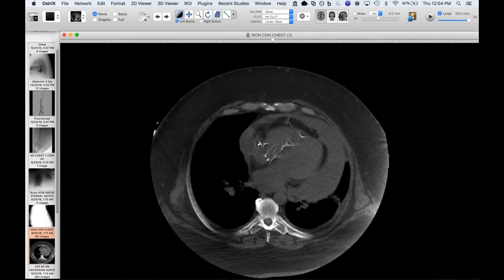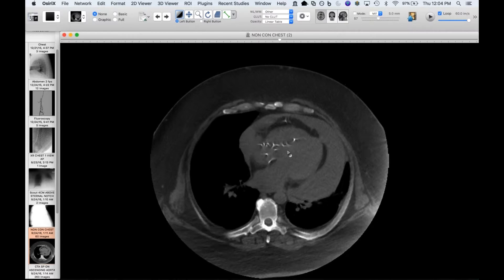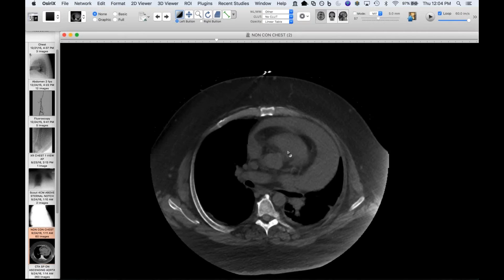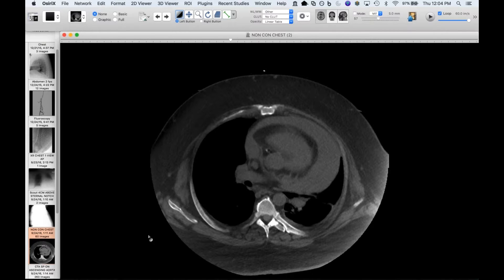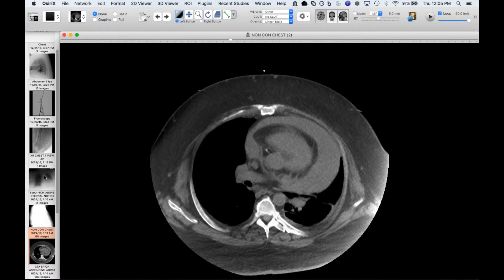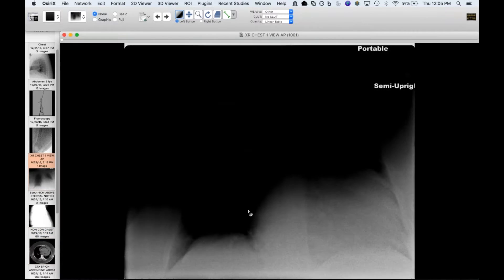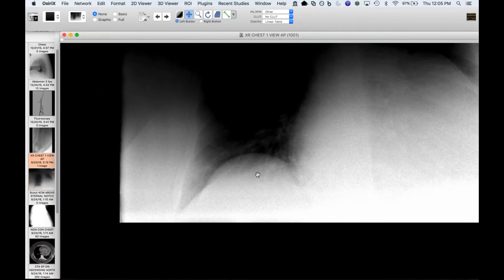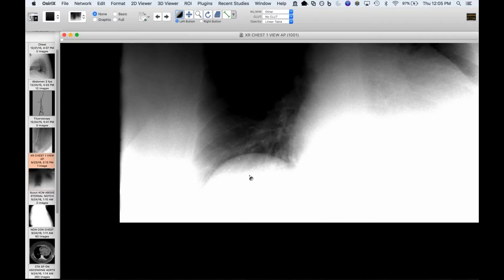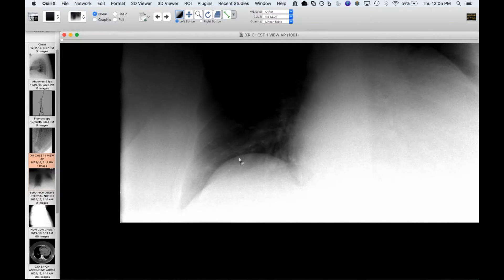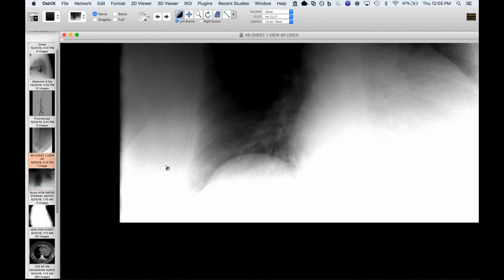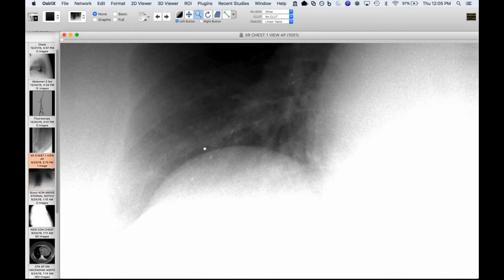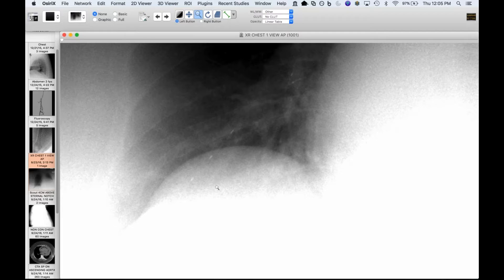What's interesting is you can see little dense foci throughout this wire or thing that's tangled up in here. Anybody want to guess what this particular thing is? I'll go back to the radiograph because you can actually see part of it down here in the right lower lobe pulmonary artery — a portion of this has embolized into the right lower lobe. You can see it has these little markers on it. Brachytherapy seeds? No — it's one continuous contiguous thing.